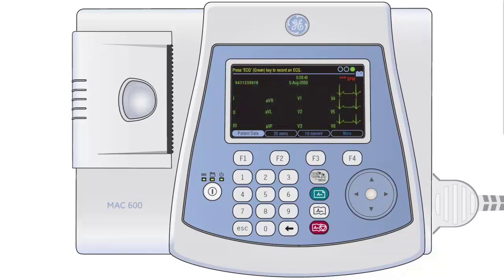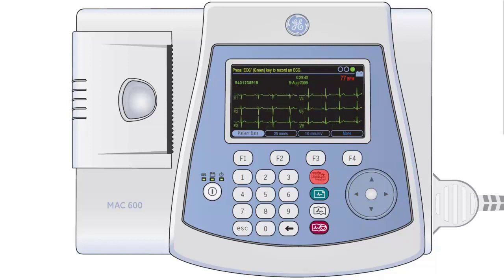The real-time ECG monitoring trace will now appear on the screen alongside the patient ID. On screen, all 12 lead views are clearly labelled and in the top right hand corner the patient's heart rate is displayed. Sensitivity and speed are set to the standard default setting and can be adjusted by using the F2 and F3 buttons if required. The Lead Display button provides you with the option to view a variety of different lead views. We would recommend that a 12 lead view is used to confirm a good quality trace is being received on all leads.